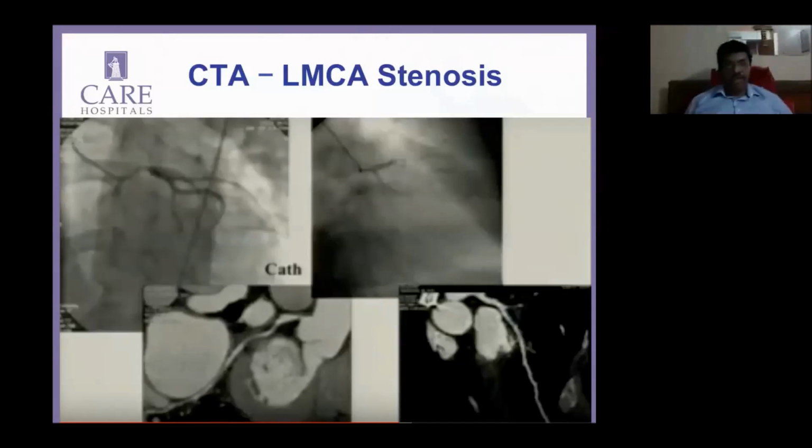Okay. So the Japanese author, I think she was a guest speaker, said she would prefer an FFR in a case where, as you said, there is a discrete lesion and you want to do something on table: she would do an FFR, confirm, and then go ahead. She also had some experience with CT in the other group, where you have other lesions and the patient is not ready, and then you would do a CT to confirm and go ahead.